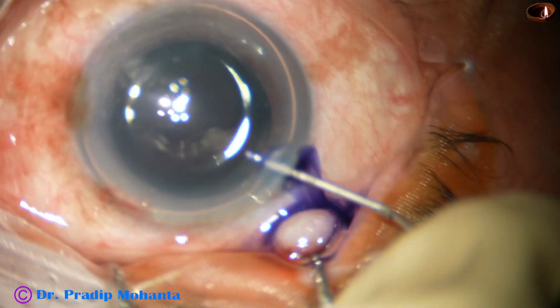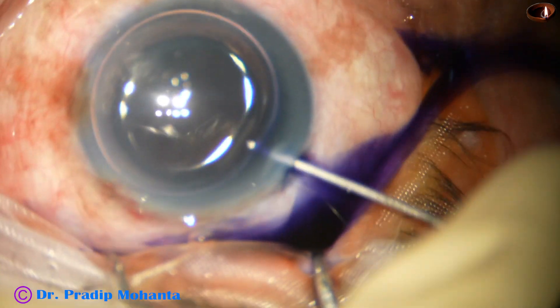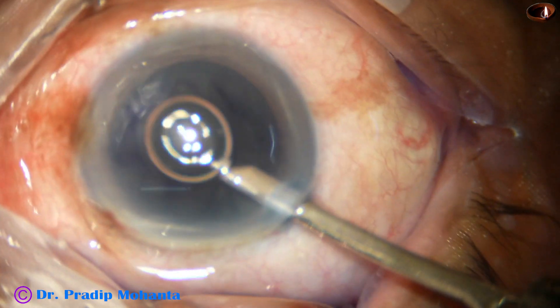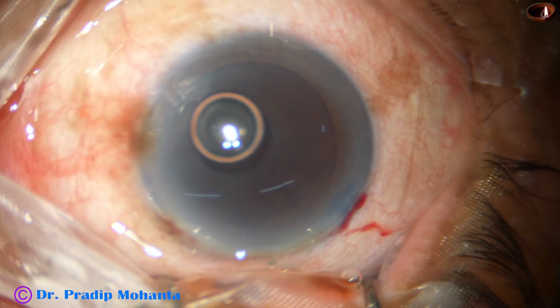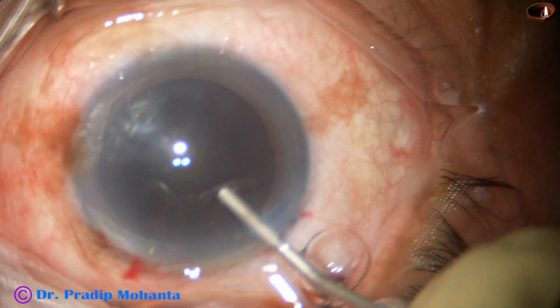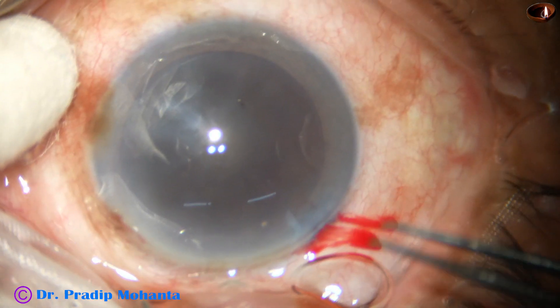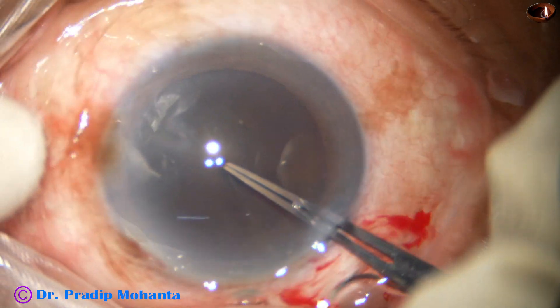In such cases it is always better to use trypan blue dye and stain the anterior capsule and do a large rhexis. My aim is to do a rhexis of about 5.75 to 6 millimeters. The anterior chamber is filled with 2% HPMC viscoelastic and now I am trying to use utrata forceps to do the rhexis.